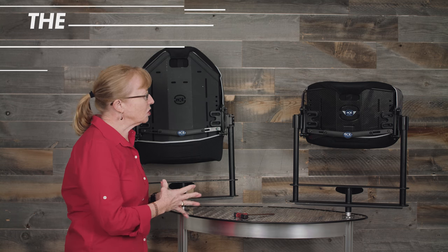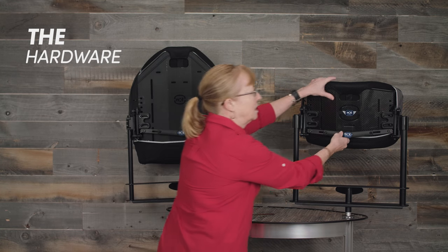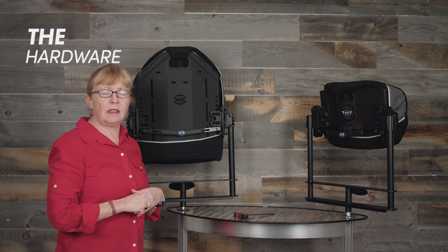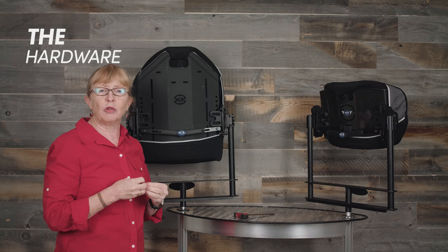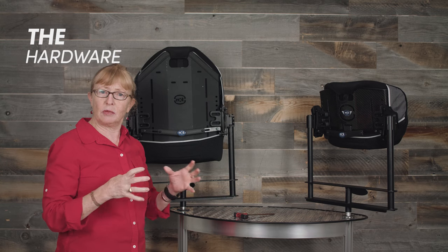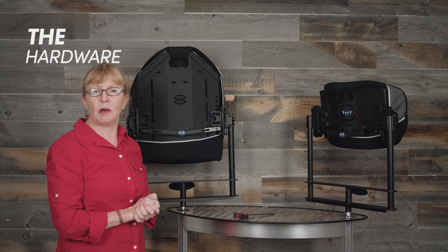The Optima is also available with a variety of hardware. You can get the quick release, but you can also get fixed hardware — either two-point or four-point — and then there's also a two-point micro fixed hardware, which is really the lightest, most minimal amount of hardware. This would be used most likely in a situation of a rigid chair that's lightweight and you want to keep it as small as possible.